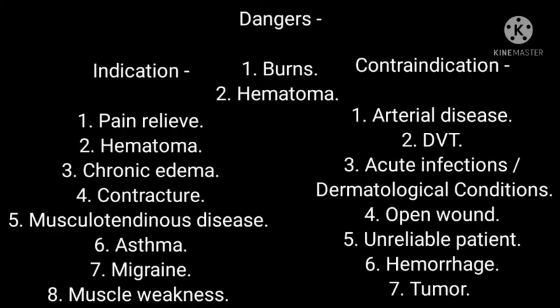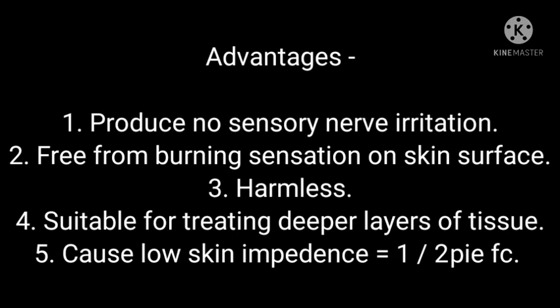Indications: pain relief, hematoma, chronic edema, contracture, musculotendinous disorder, asthma, migraine, muscle weakness. Contraindications: arterial disease, deep vein thrombosis, acute infection or dermatological condition, open wound, unreliable patient, hemorrhage and tumor. Dangers: burn and hematoma. Advantages: produces no sensory nerve irritation, free from burning sensation on skin surface, harmless, suitable for treating deeper layers of the tissue, causes low skin impedance. Impedance equals 1 upon 2 pi fc.